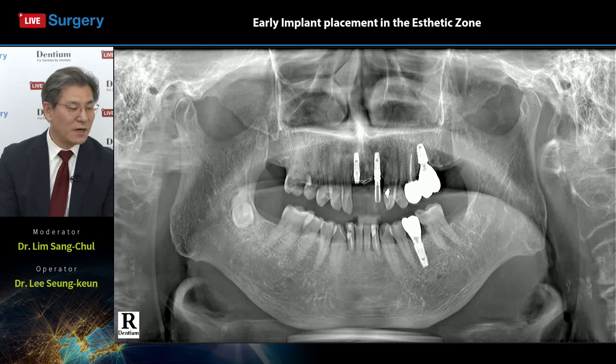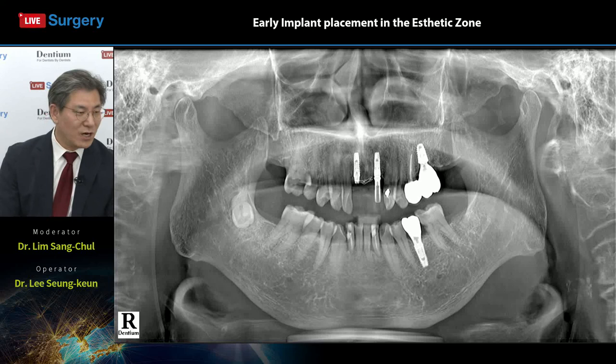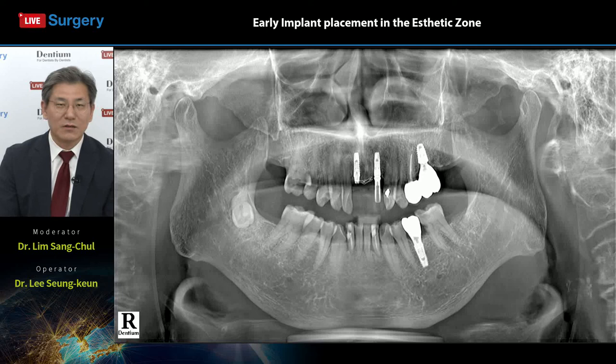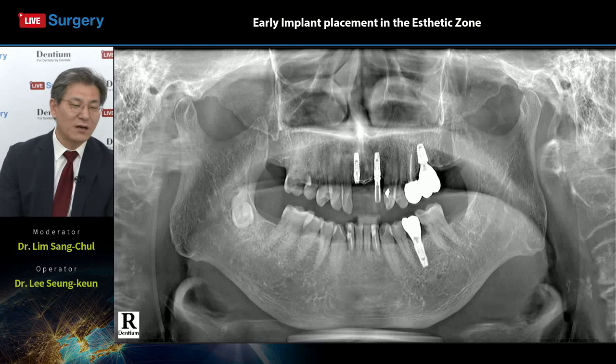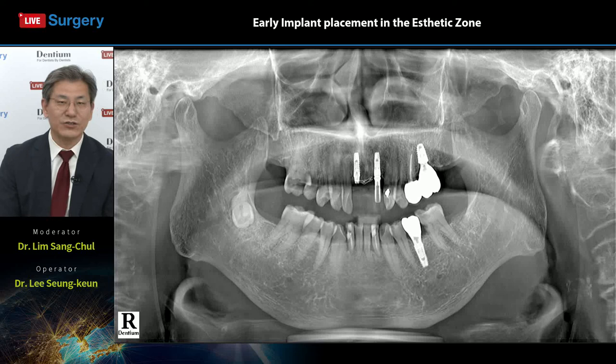And what about mesiodistally? Because number 21 will be a pontic area, it doesn't matter for mesiodistal position, but for number 12, the lateral incisor, we should keep 1.5 millimeters, right? So the implant fixture should be installed at minimum 1.5 millimeters from the neighboring natural tooth root surface. It's very nice, well done. After maybe 5-6 months, we can see very nice, well done new bone forming around this surgery area. And also we can see the final restoration and very nice soft tissue healing at the contour augmentation site, right?